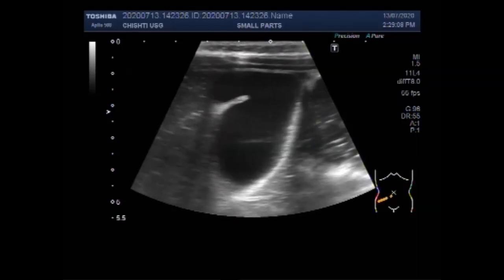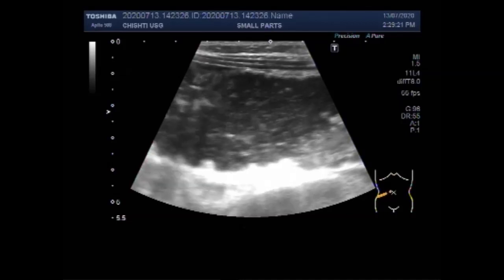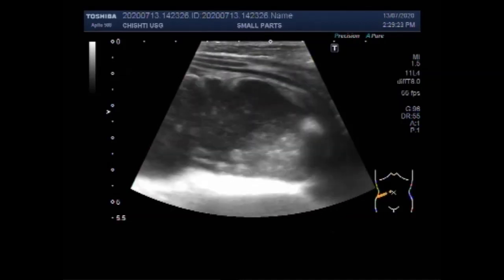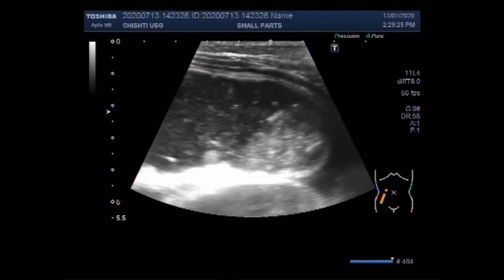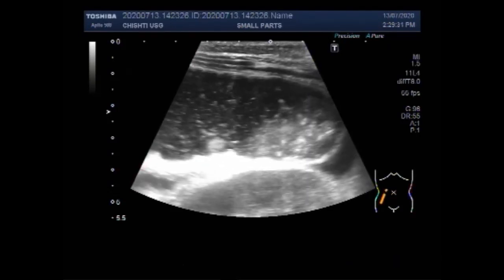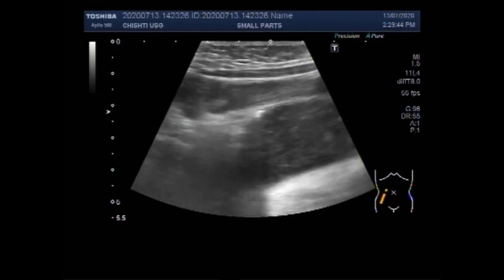The main findings in bowel obstruction include dilated gut loops with or without the presence of fluid levels. This is the gallbladder and the liver. On ultrasonography, bowel obstruction is considered to be present when the lumen of the fluid-filled small bowel loops is dilated more than 3 cm in adults, the length of the segment is more than 10 cm, and the peristalsis of the dilated segment is increased.